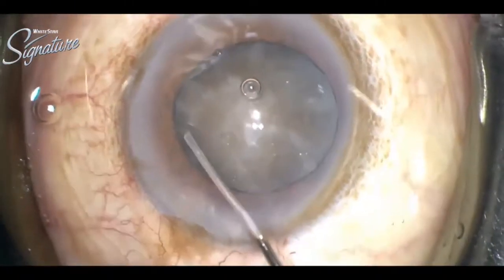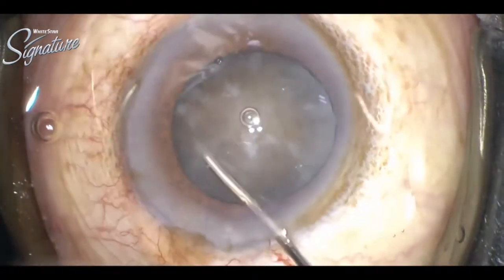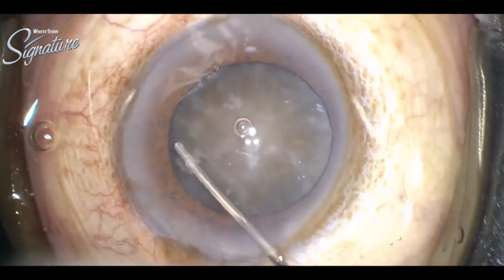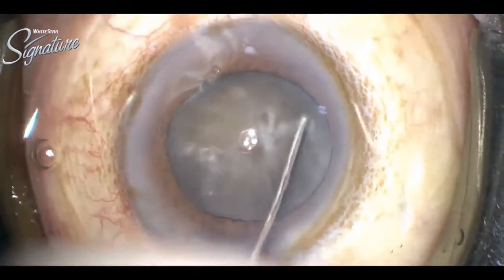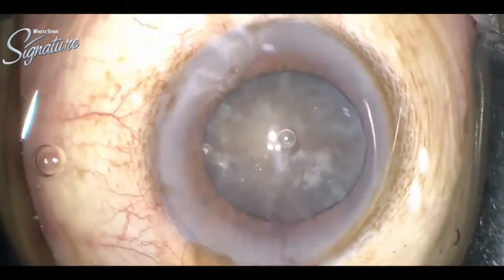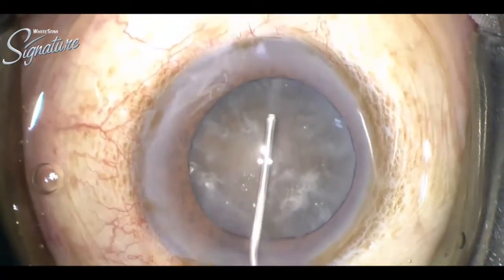Then gentle and controlled hydrodelineation was done. You can see how the nucleus rises and then it is depressed at the center, and after seeing that the nucleus is nicely rotating, we can proceed for phaco.